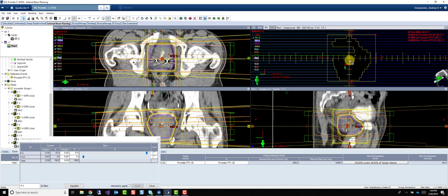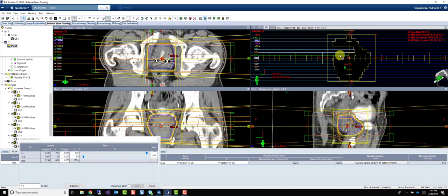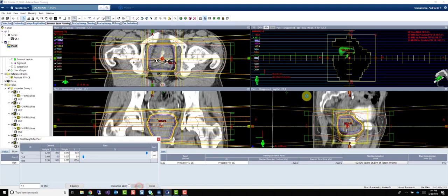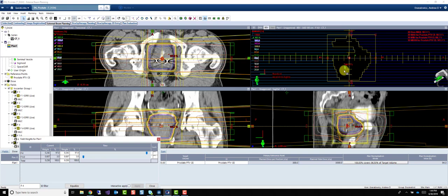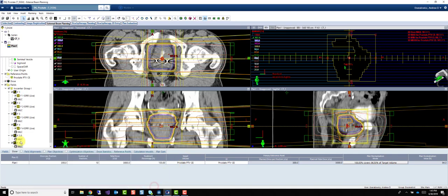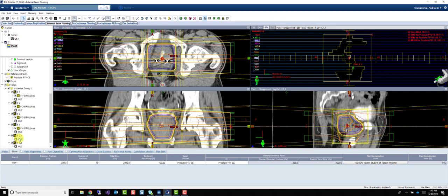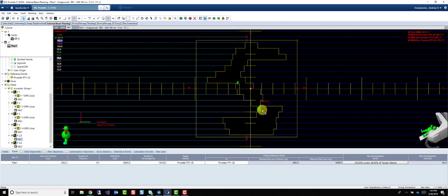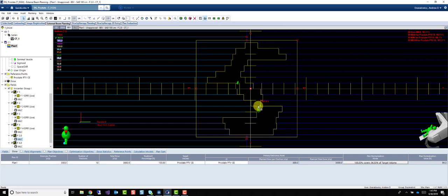So what ends up happening sometimes is, just a second ago, all of our 107 was up higher. See that? And then when we block that, some bounces back here. And that just has to do with scatter. And it sometimes has to very slightly normalize differently to maintain this coverage, which will change your isodose distribution. So when it does that, and it's very small amounts like that, before I create a new field-in-field, I'll go look at my previous ones to see if I can make some just very minor changes in order to block those areas. And in this case, I can.